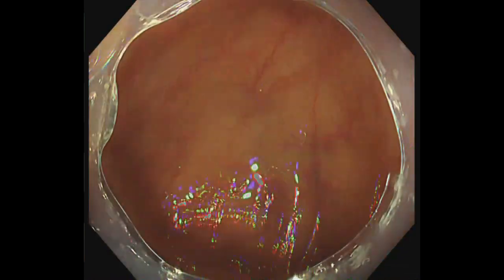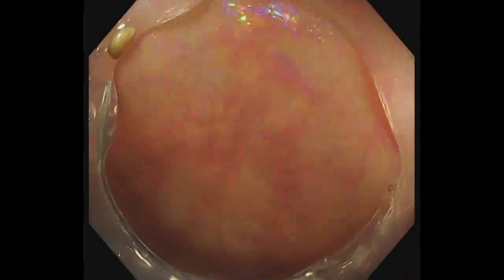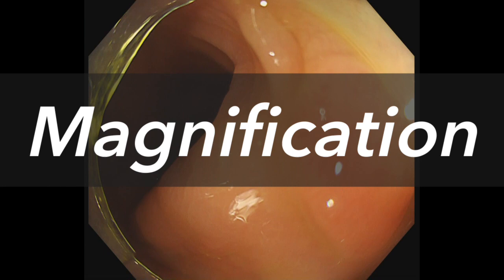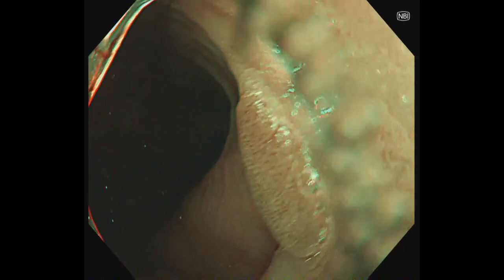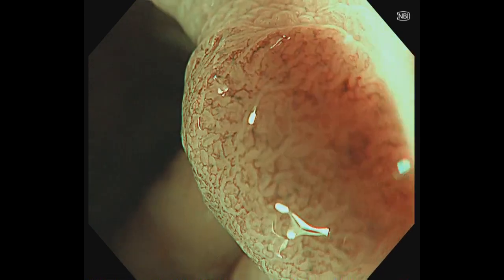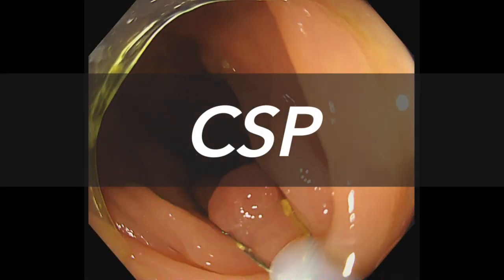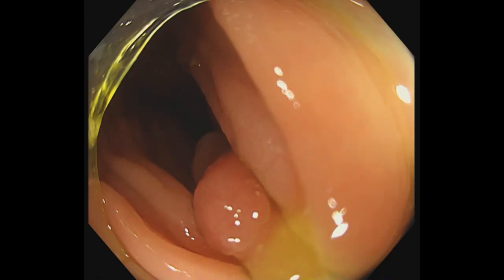The tape hood has good firmness for pressing the mucosa to observe behind the folds. It also helps detect polyps and observe them under magnification by maintaining an appropriate distance from the mucosa. Polyps above the flexure can be adequately resected while observing the entire polyp.